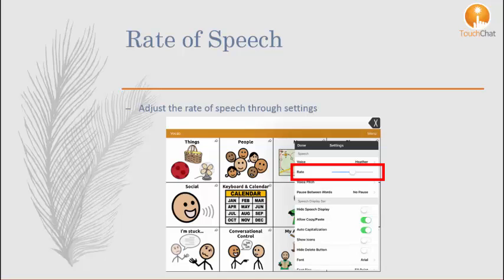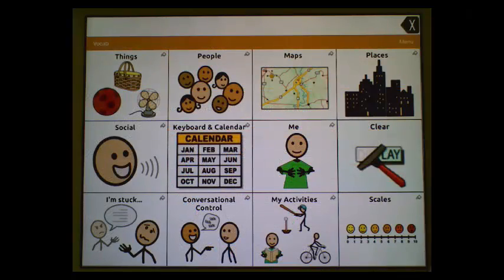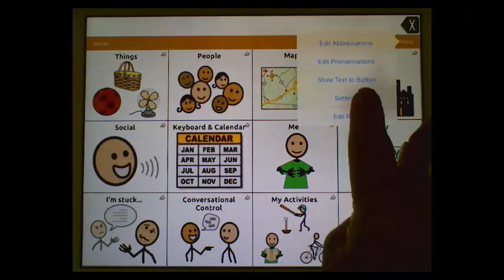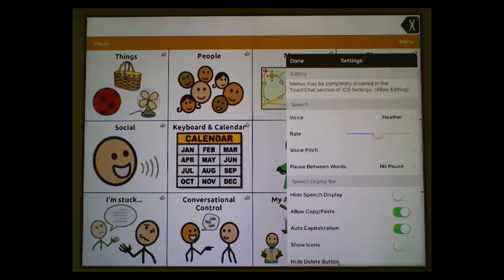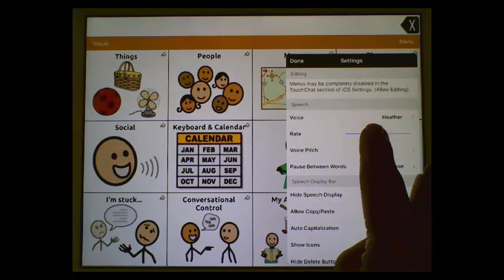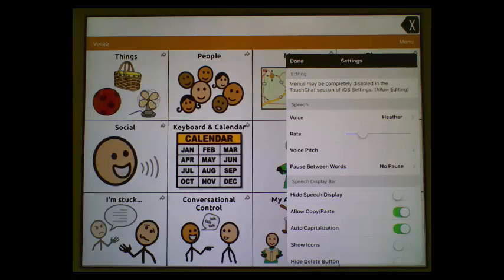Within the settings, under speech, we can slide the rate bar to adjust the speech rate. Let's take a look at the setting on the device. Tap menu, tap settings, scroll to speech, and we can slide the rate bar back slightly to slow the rate of speech.